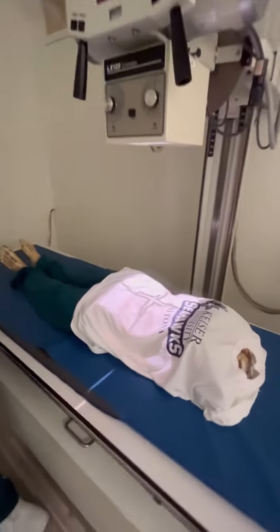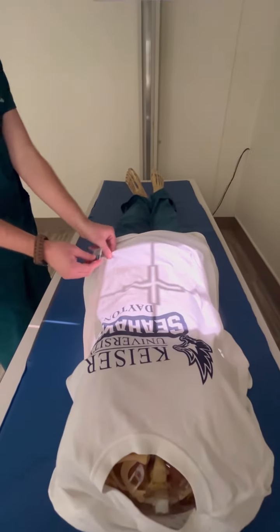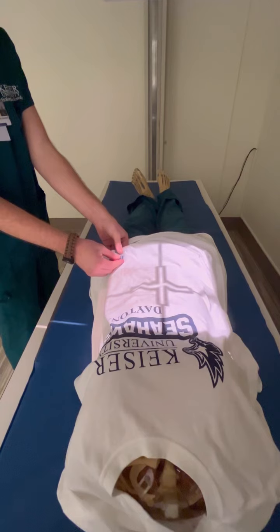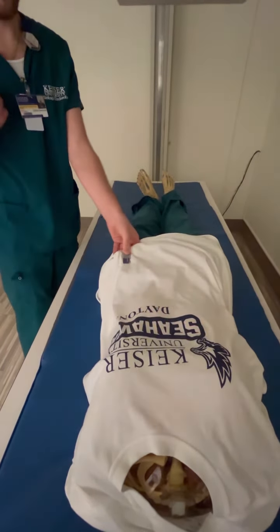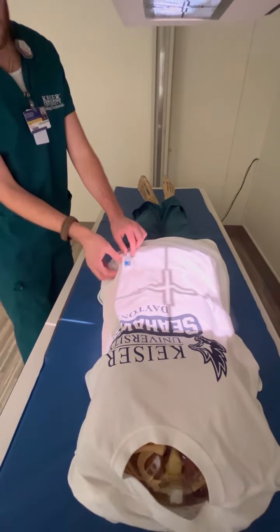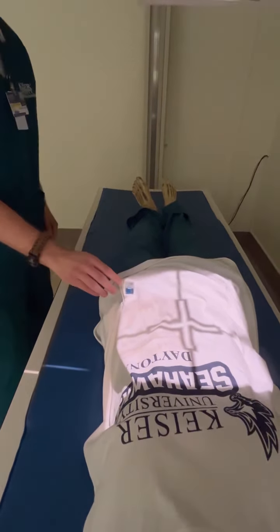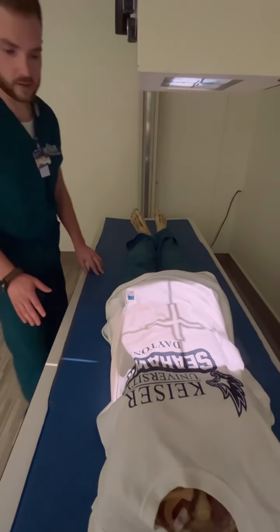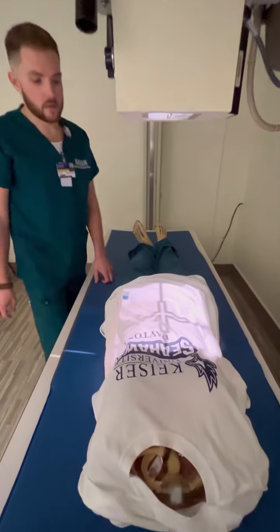Okay, so now I'm going to grab my marker, make sure I place it on the right spot. She is in the AP position, so my left marker is going on my right side. And Sam showed me this nice trick to fold the clothes to keep the marker flat on the table. So now that I know I'm all lined up, pretty sure the xiphoid's lined up too, I think we're good to shoot.